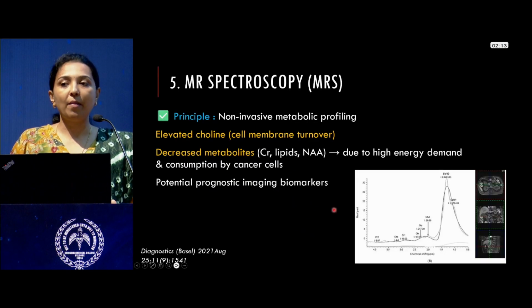Now, the last MR-based technique I want to talk about is MR spectroscopy.